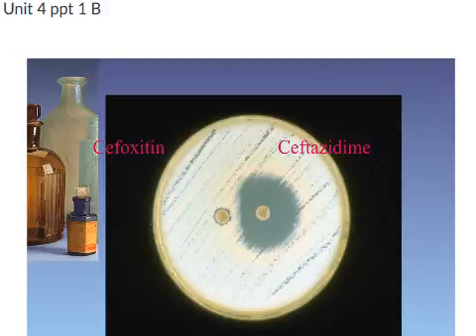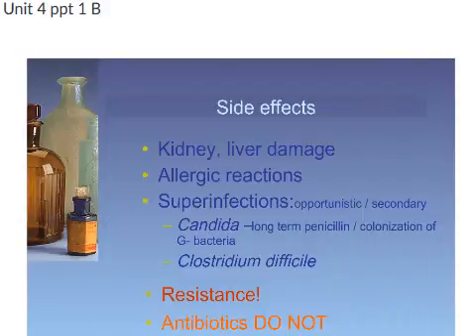So, assuming we were staring at one another in class, I would ask you if this is synergistic or antagonistic, and hopefully you would see that in this case, one is resistant and one is susceptible. So therefore, this is an example of antagonism in drug usage. This drug is not working well in combination with this drug.